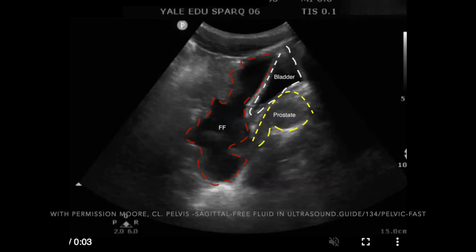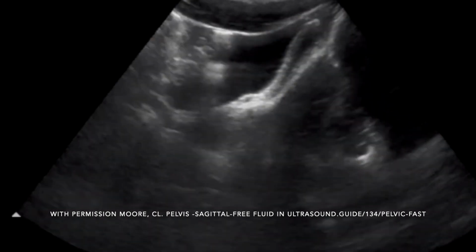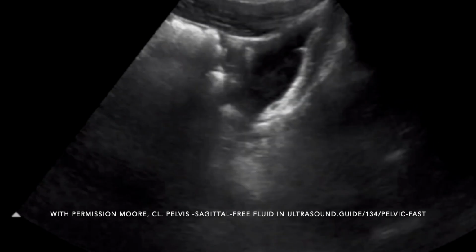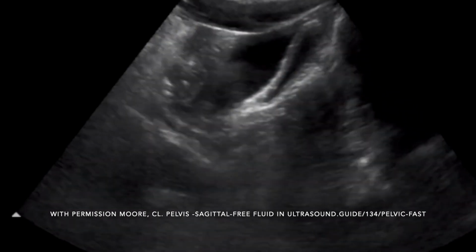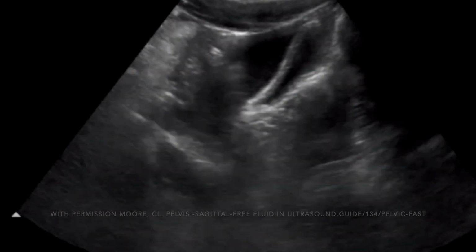Moving on to the male pelvis FAST exam in long axis. Again, this will have more of an evaluation of the lateral extent of an abdominal or pelvic bleed. In this image, you can see the prostate outlined in yellow, the bladder outlined in white, and then the free fluid, which is more cranial to these structures or toward the patient's head. Again, it's very important to remind the students that once they have acquired a long axis view of the male pelvis for the FAST exam, it's imperative that they fan laterally to both lateral walls to evaluate the extent of the pelvic bleed. If they don't, they could really underestimate it.